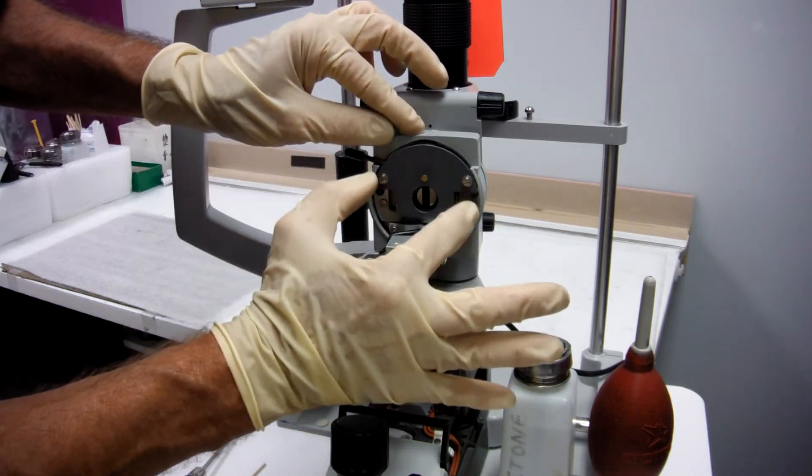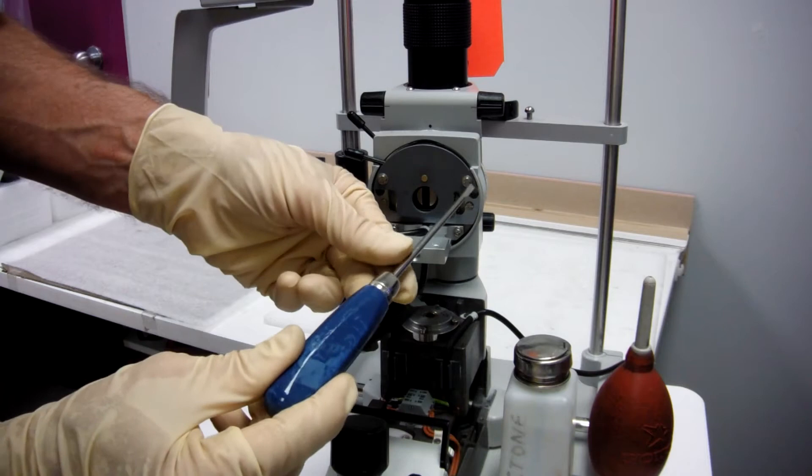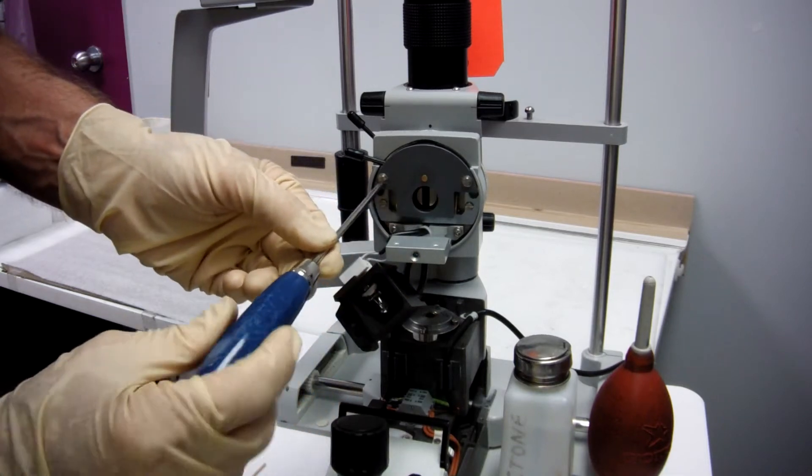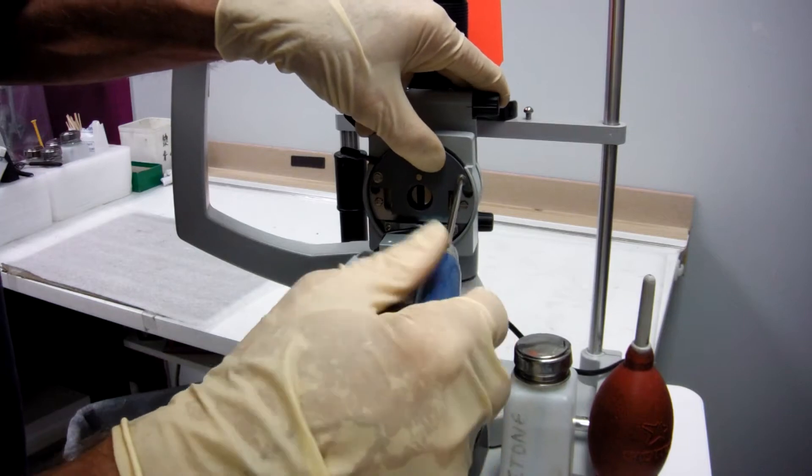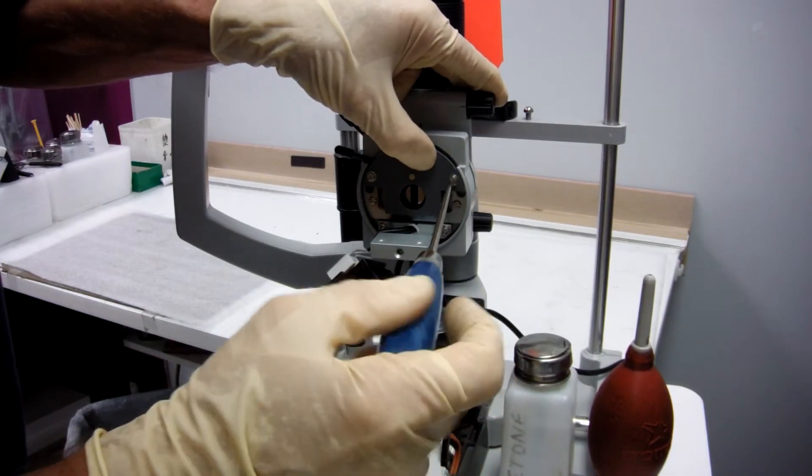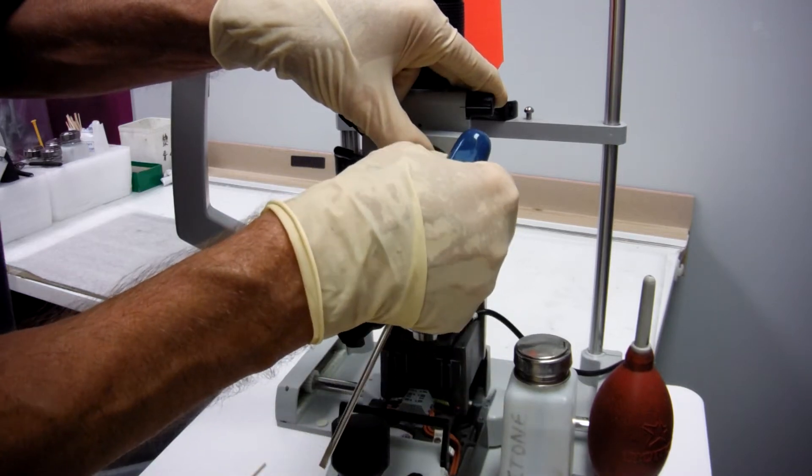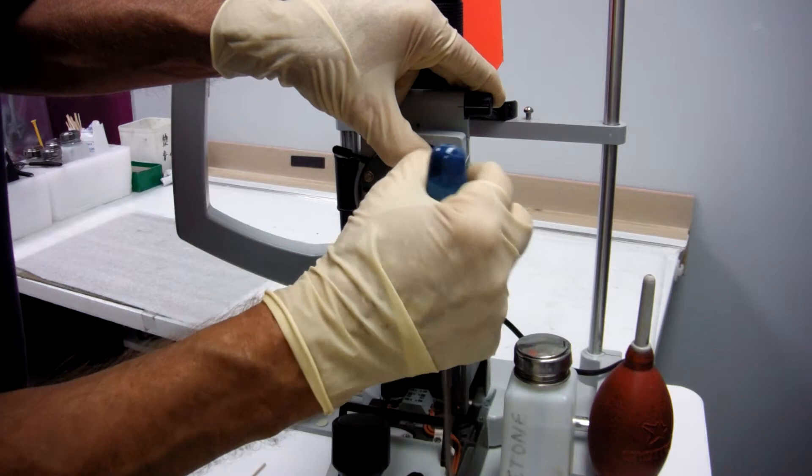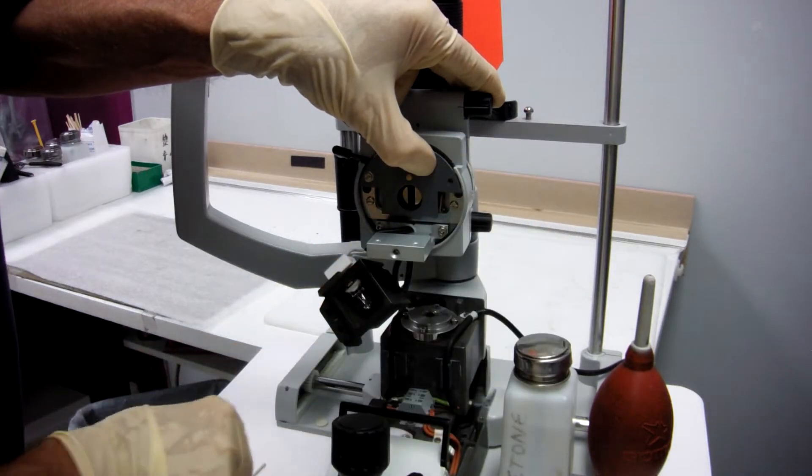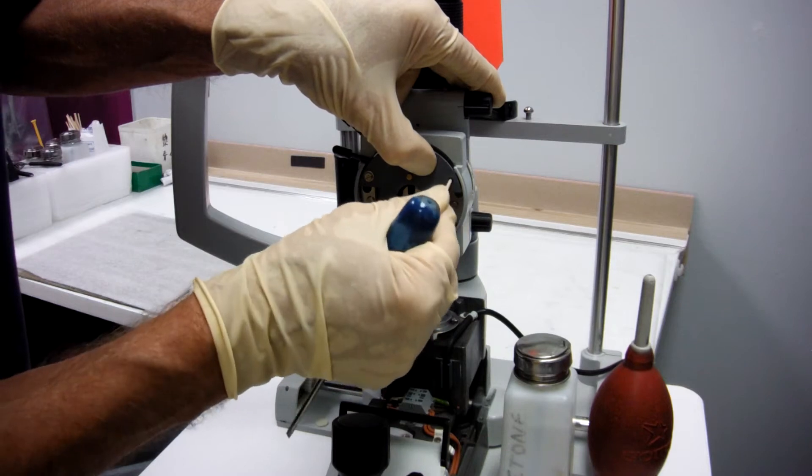You can take off the diaphragm assembly by these two screws. Take the screw out and I'm going to put a toothpick in its place.